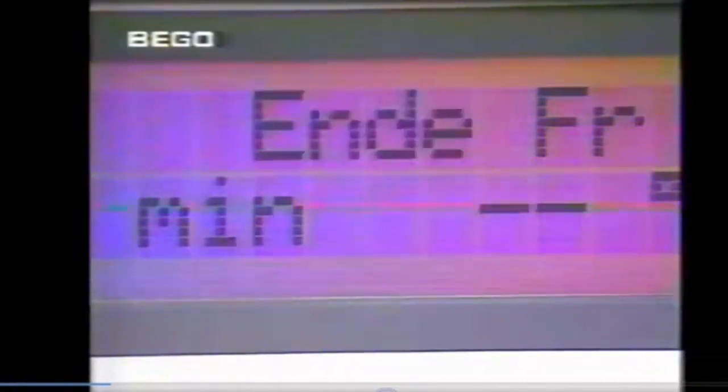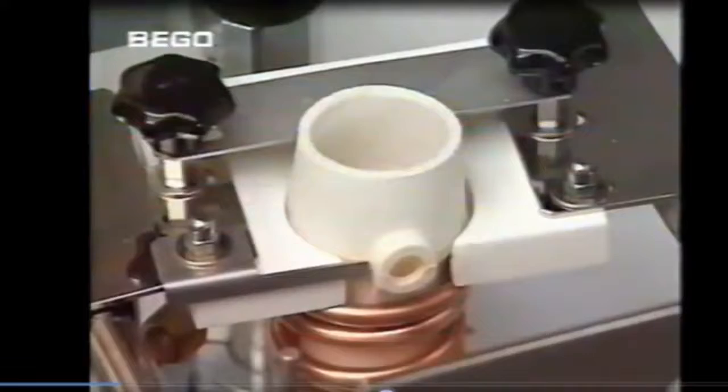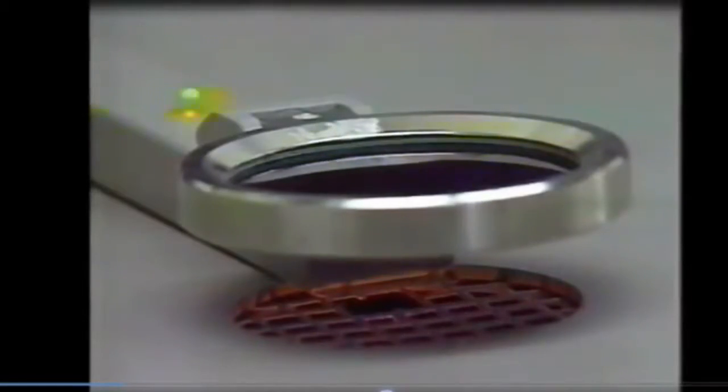The preheating furnace has now reached the final temperature. The end of the programmed holding time is indicated by visual and acoustic signals. Crucible and muffle can now be placed in the casting machine. Part 6 of the Bego Cobalt Chrome video provides detailed information about casting, finishing and polishing.